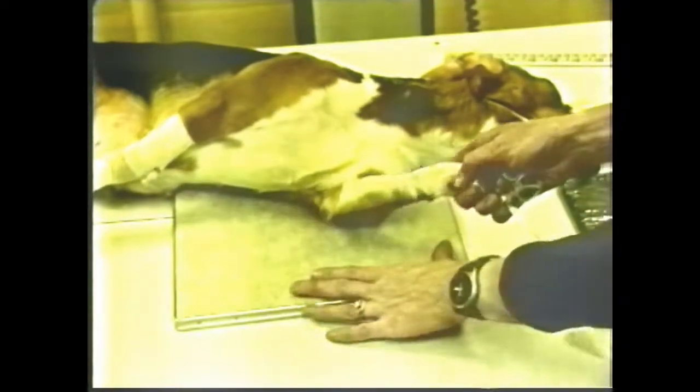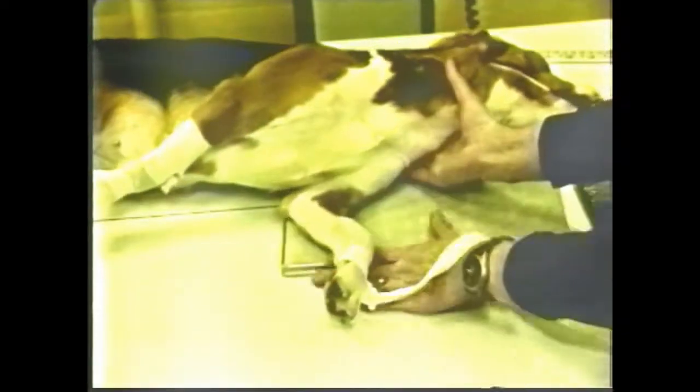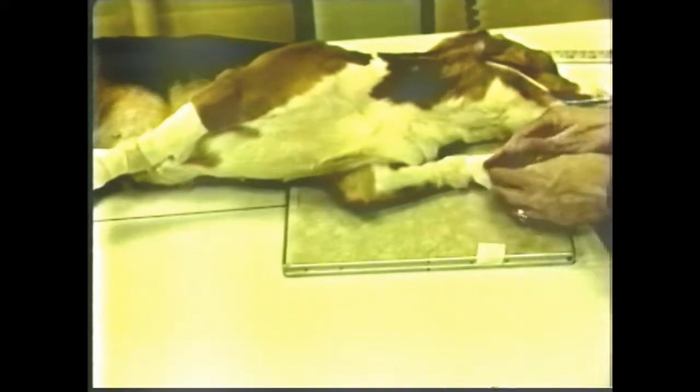Note the tape that was underneath the foot when we started to move the leg. This tape was placed on the cassette at the previous exposure so we would remember which end of the cassette had been exposed. This helps prevent double exposures. It is also worthwhile to keep the body part going in the same direction, which we are demonstrating, because of the ease of interpreting the films that way.